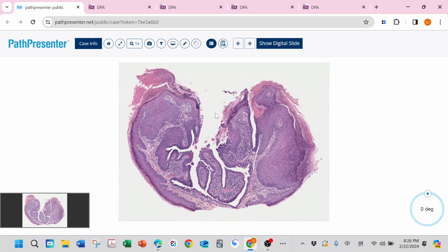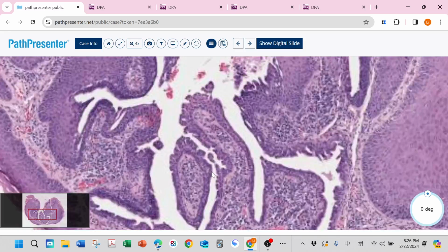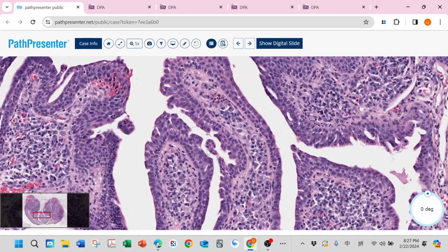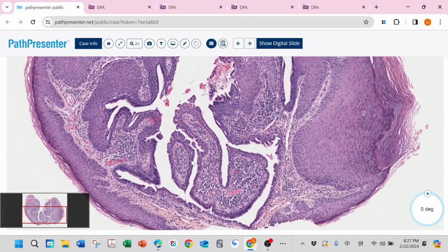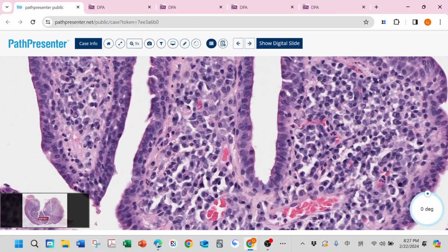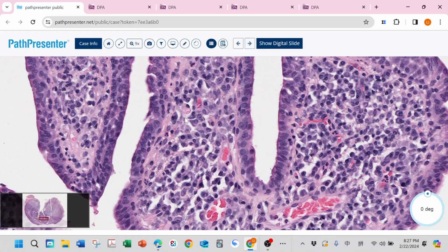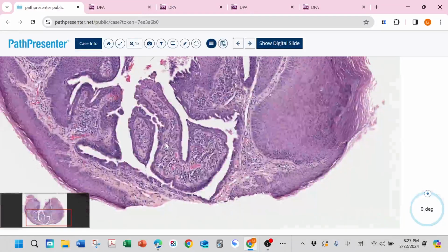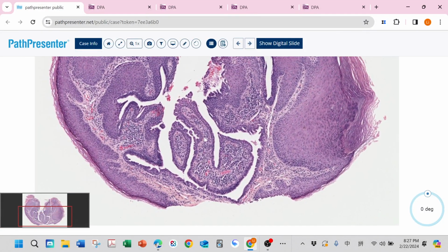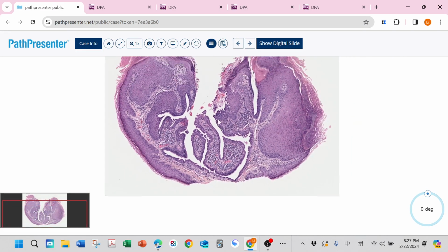Usually it connects to the epidermis, not just a dermal nodule, but when we zoom in, we can still see our friends, the two-cell layer, epithelial cell and myoepithelial cell. Then we usually can see tons of plasma cells in the stroma. So epithelial cell and myoepithelial cell forming a two-cell layer, and the location in the scalp, plasma cells inside, really good for SCAP.